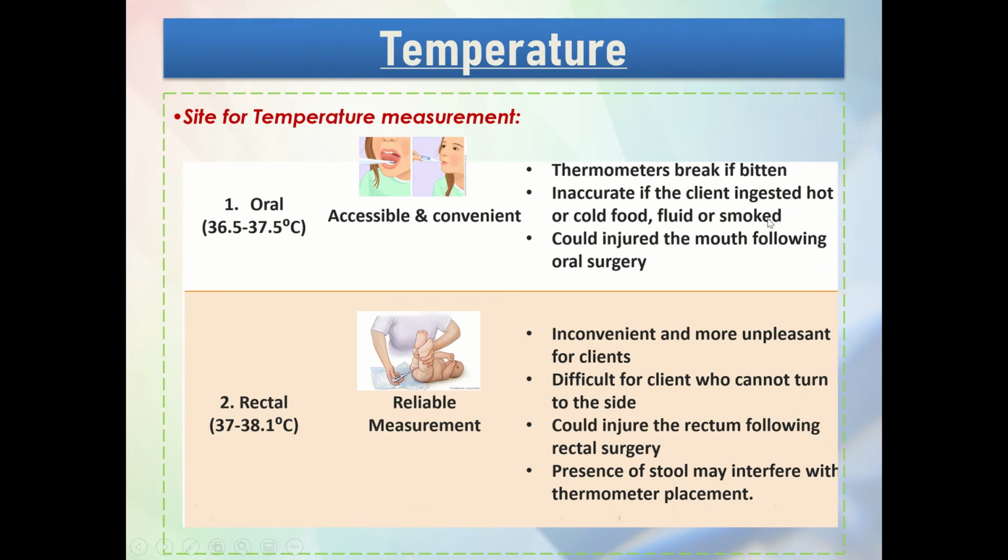And then for the disadvantages, thermometers break if bitten, baka makagat ni pasyente. So definitely it might get broken or baka masira. And then inaccurate if the client ingested hot or cold food, fluid or smoke. So kung kakakain lang ni patient ng mainit, kainom lang ni patient ng mainit or malamig, so definitely makaka-apekto yun sa ating reading. And then it could injure the mouth following oral surgery.